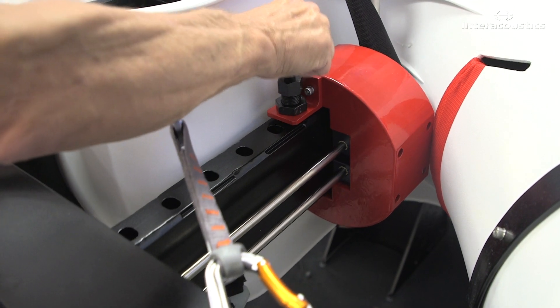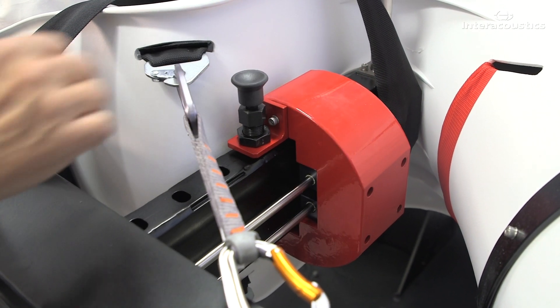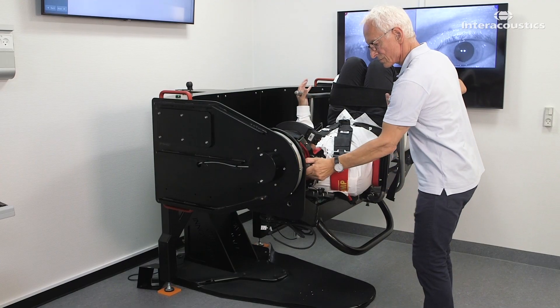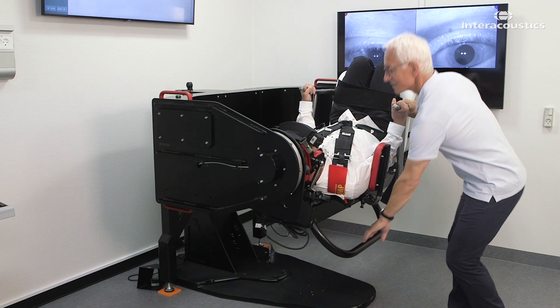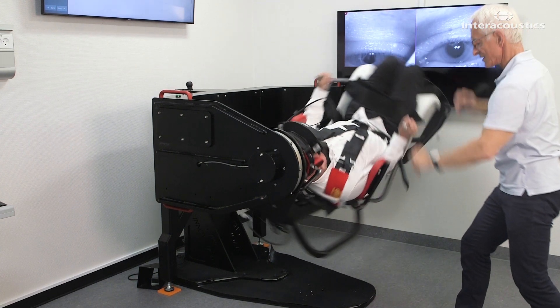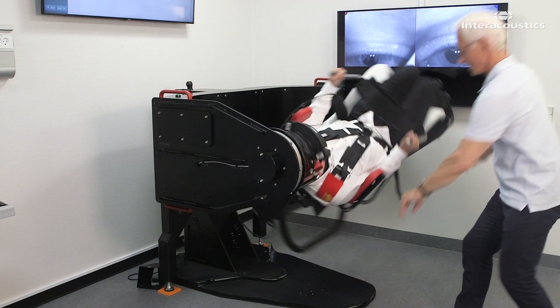Otherwise, adjust the counterweight under the seat of the chair with the patient's right ear towards the ceiling. Give the upper D-shaped handle a healthy push, accelerating the secondary arm with the patient into a fast spin over the unaffected healthy ear.